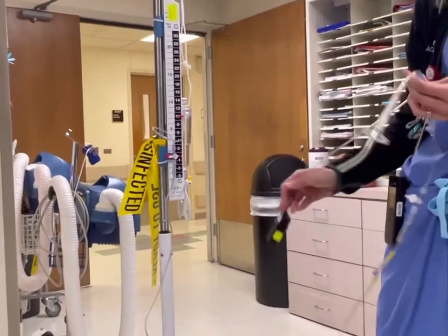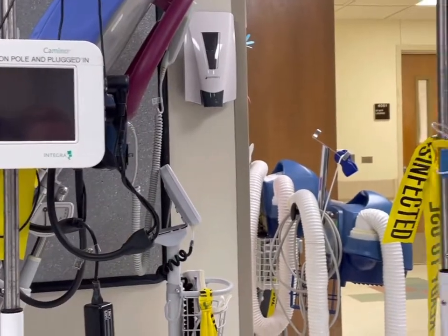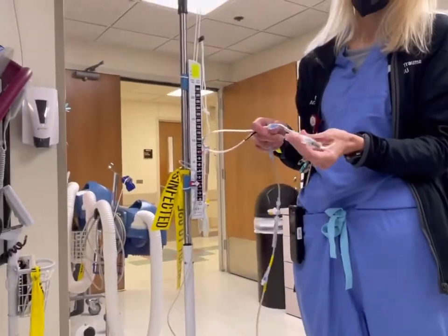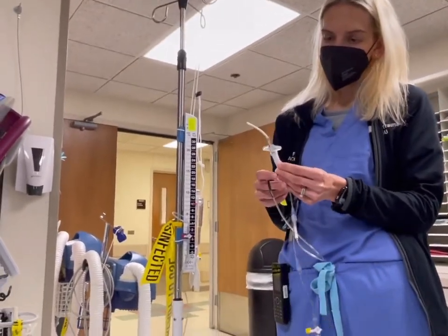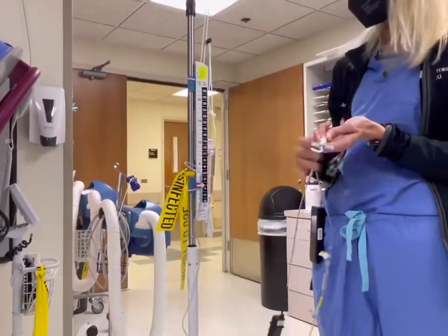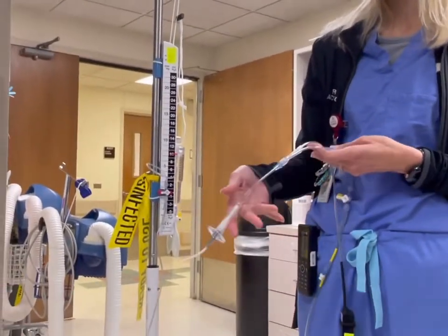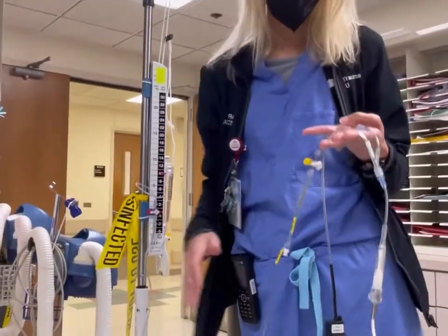Yeah, Dr. Shibley likes to do both. He likes to monitor off the bolt's side with the Y connector and also drain. But it works basically the same way as a regular EVD. He just likes the T connector with the little bolt system in it, so that's why we have this going on. And it's set up the same way, basically. I don't have much more to comment on that. I just wanted to show you the difference between the tubing of the two different things that you'll see and the Camino system and how it's connected to this actual box.